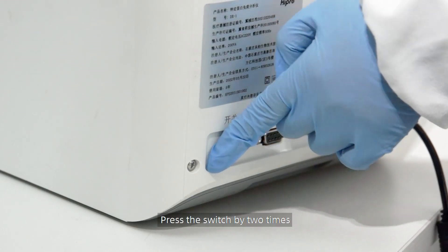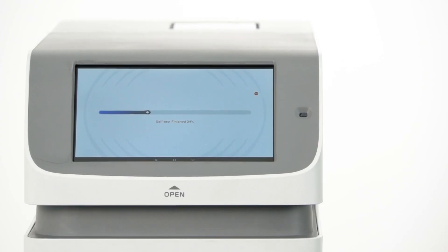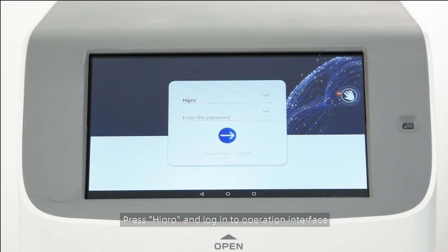Press the switch twice. The instrument will perform a self-test. Then press HiPro and log in to the operation interface.